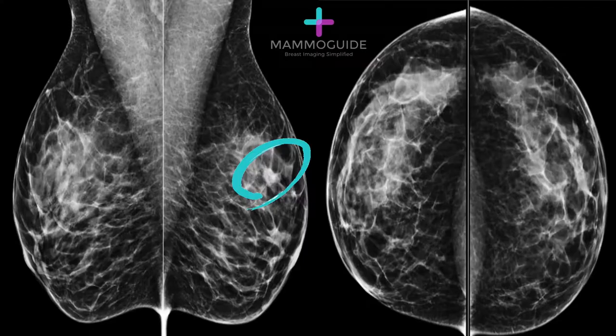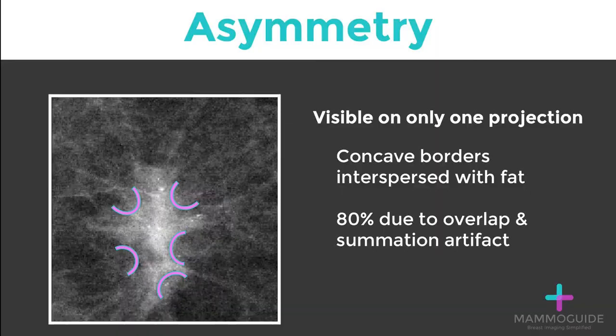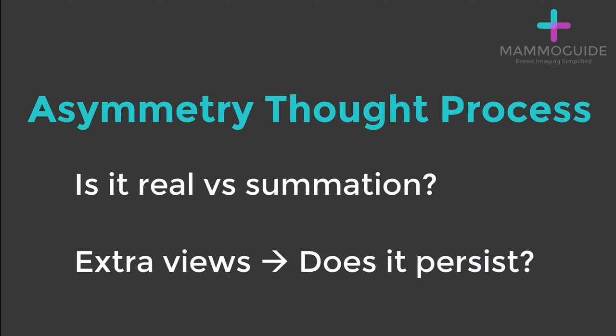On this screening mammogram, there is an asymmetry in the superior left breast on the MLO view. An asymmetry is visible on only one projection, so either the craniocaudal or medial lateral oblique view. It has concave borders that are interspersed with fat, as opposed to the convex borders and defined margins of a mass. Approximately 80% of asymmetries are due to overlap or summation artifact.